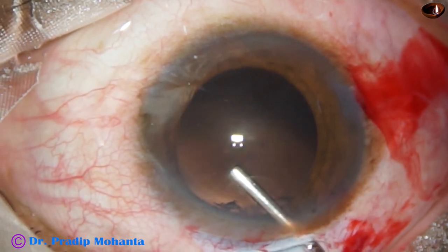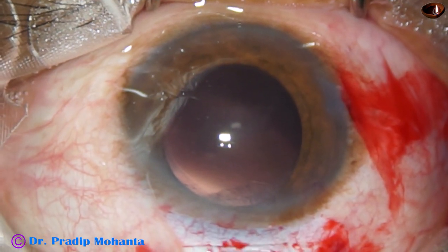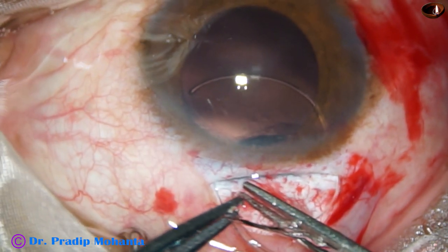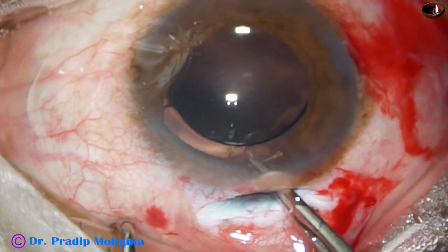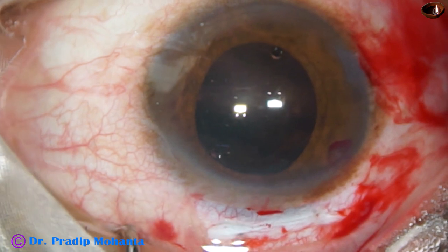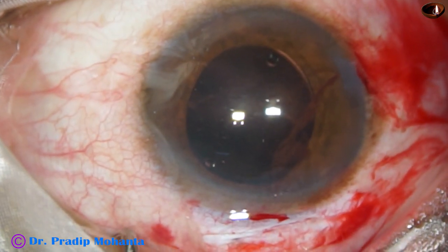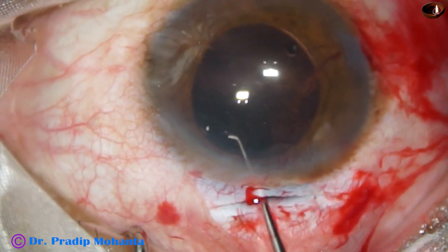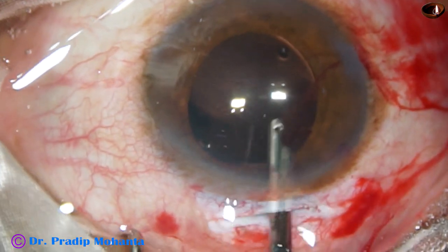Viscoelastic is injected to fill the capsular bag as well as the anterior chamber. Now this is the IOL — a PMMA rigid lens of 6 mm diameter — and the lens has been placed in the capsular bag. Two instruments are used to hold the lens so that the leading haptic goes into the capsular bag. The lens is dialed to ensure that both haptics are in the capsular bag.